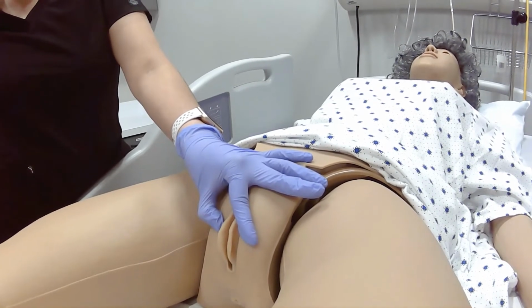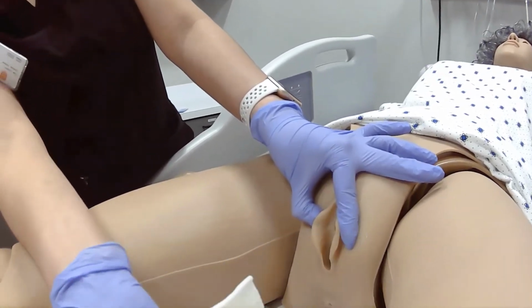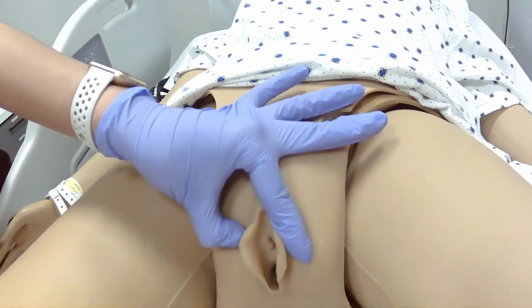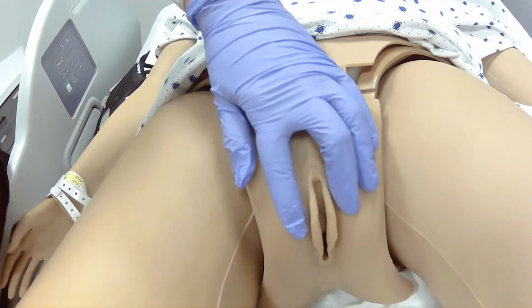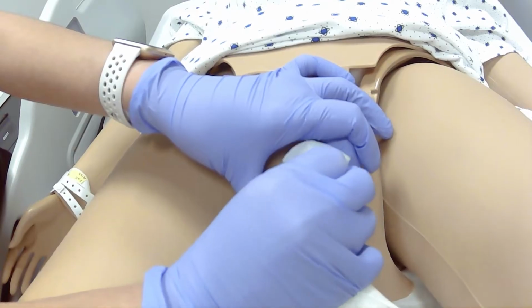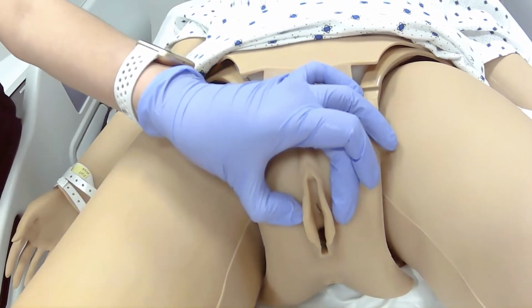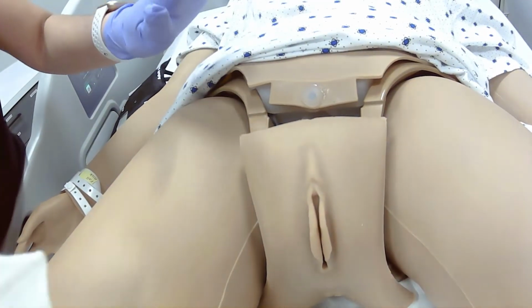So the middle is going to clean the urethra, okay? So make sure you're holding open the labia with your index finger and your thumb, or this way, whatever works for you. So one wipe, top to bottom, down the middle, and then throw that away, get a new wipe. So now I can let go.